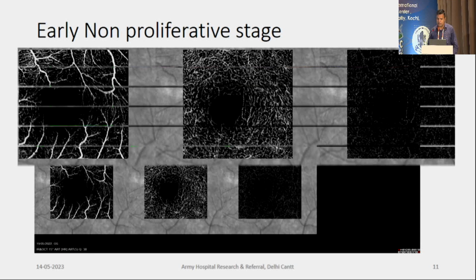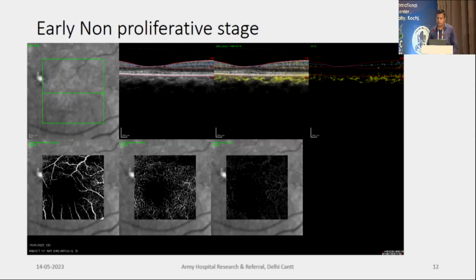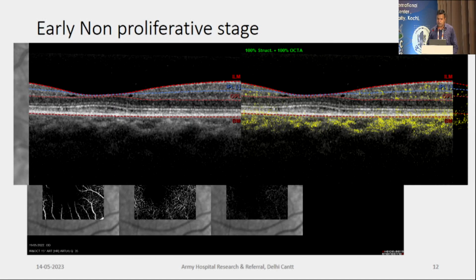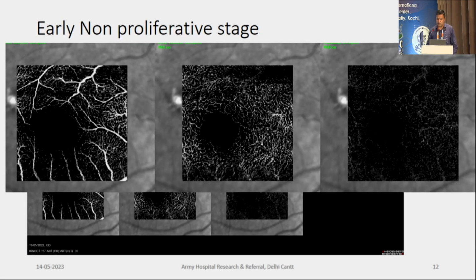macular telangiectasia. The important point is that you should be able to see similar changes in the fellow eye. In the fellow eye also, we saw these small two spaces towards both ends of the fovea, and when you looked at the OCTA images, the diagnosis was clinched.